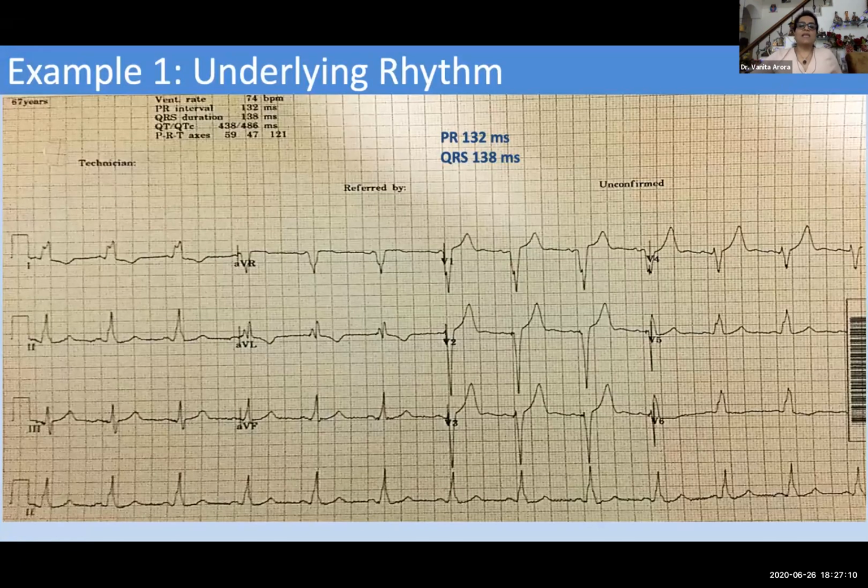So I will discuss a couple of examples with you whereby we have done the programming and made the patient's parameters better. This is the baseline ECG of the patient. If you see, the QRS width is around 140 milliseconds. There is some notching on lead 1 and even on leads V5, V6. The PR interval is short and it is normal. So this patient was given a biventricular pacemaker.